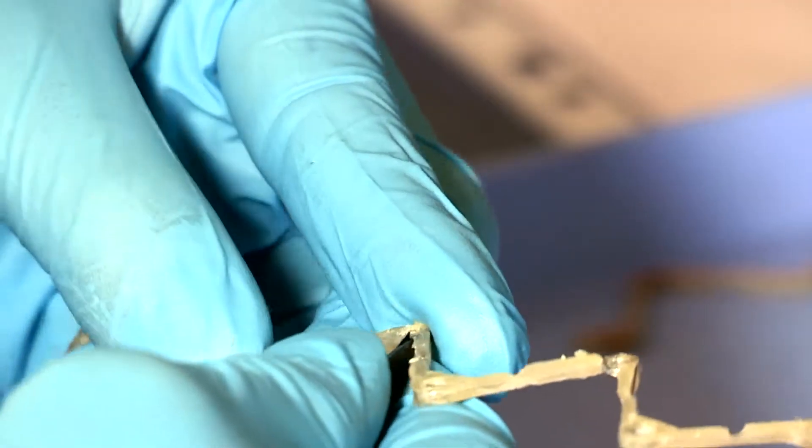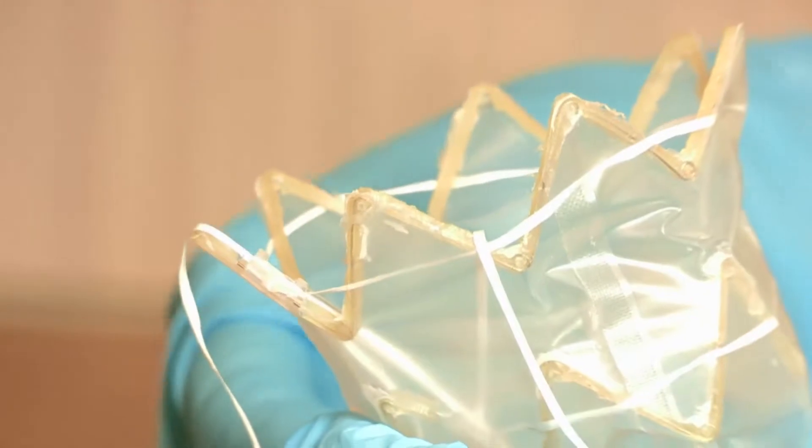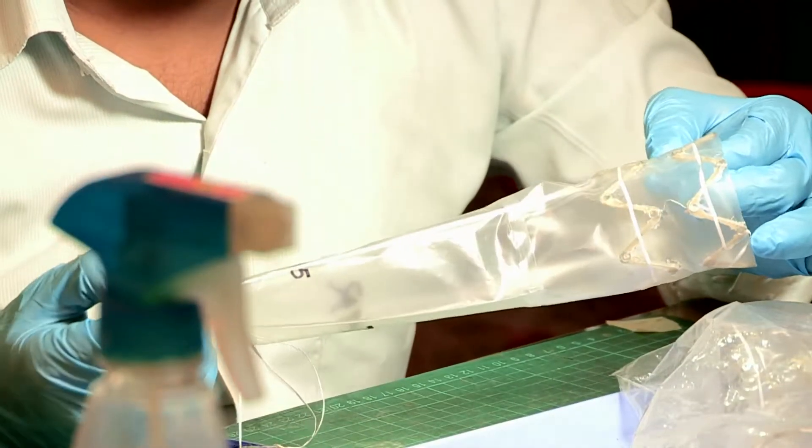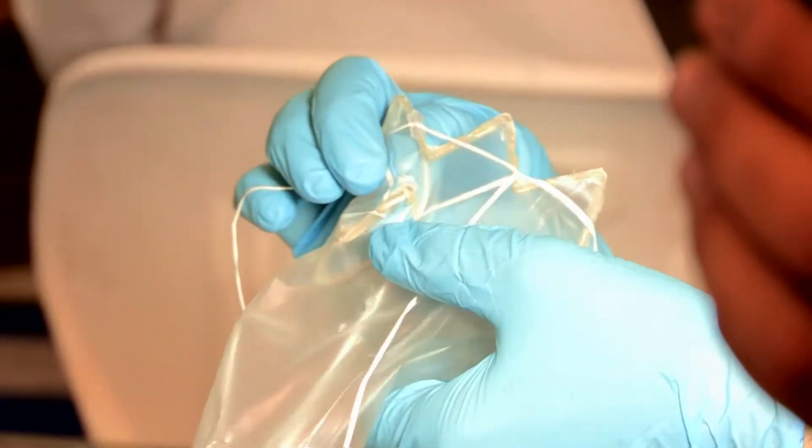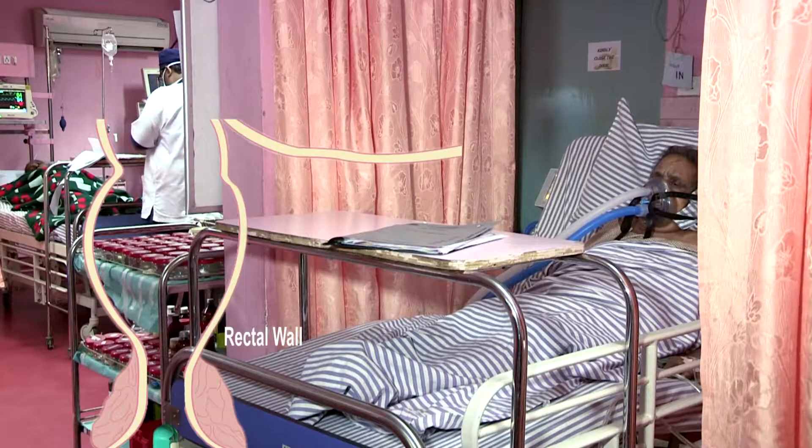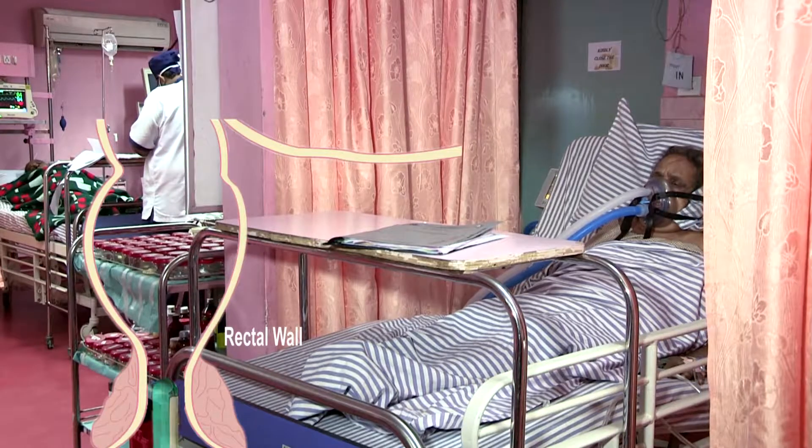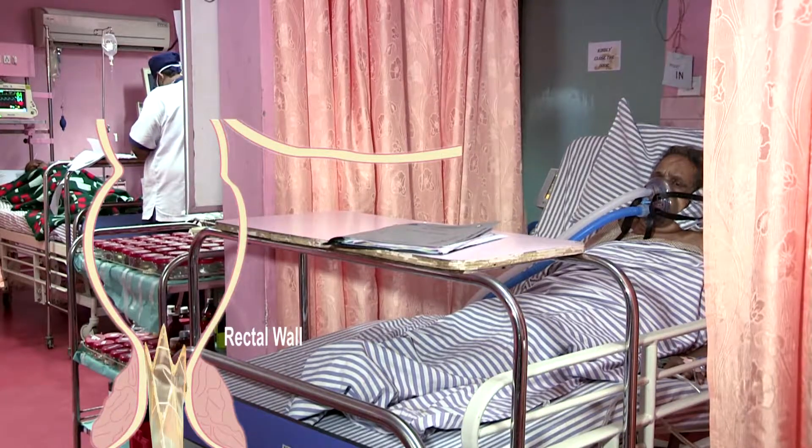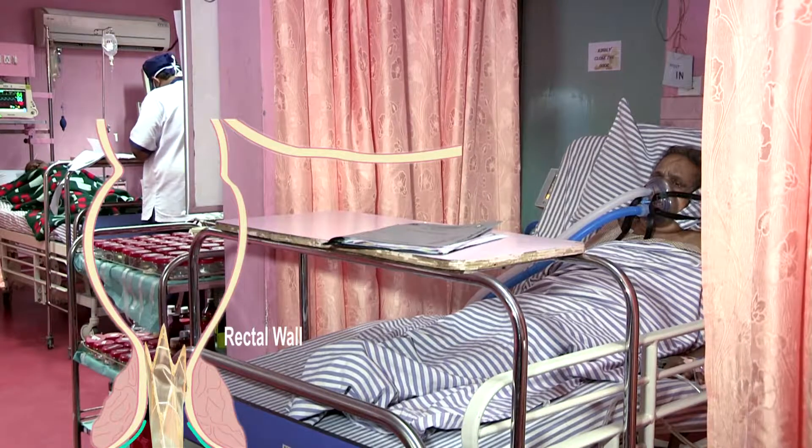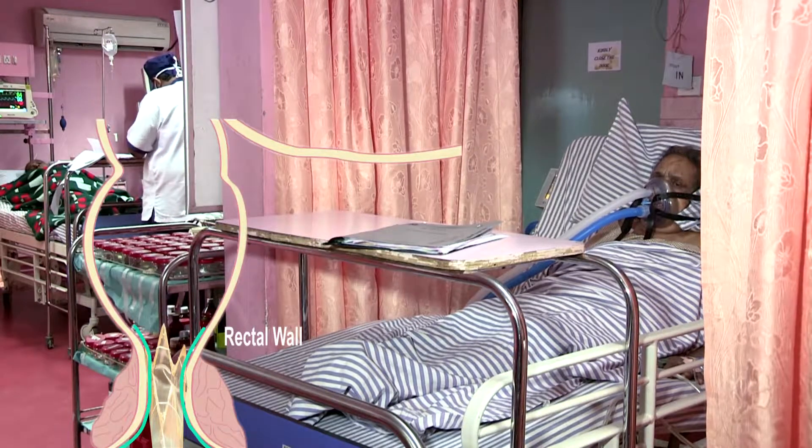What you are seeing here is at the heart of this innovation. Gradually taking shape is this lattice diverter. The striking technical feature of this stool diverter lies in its ability to constantly remain in step with the movement of the rectal wall muscles, be it at rest or during peristaltic movement. And this is how it achieves diversion of fecal exudate while minimizing leakage.